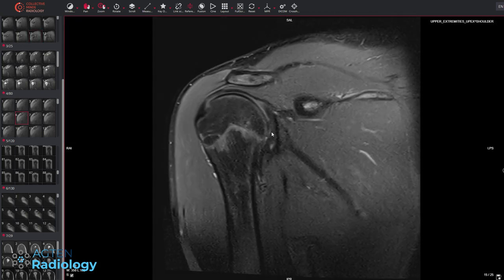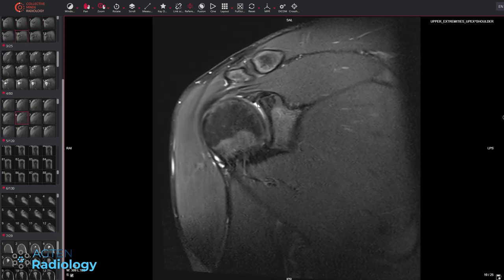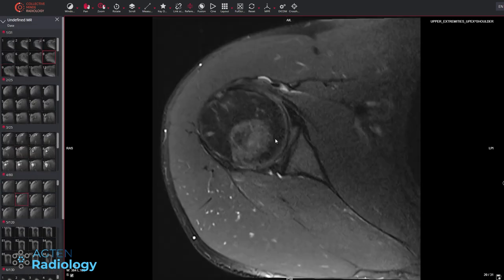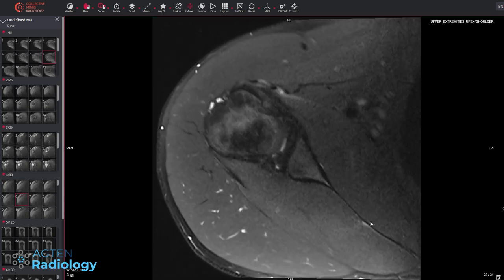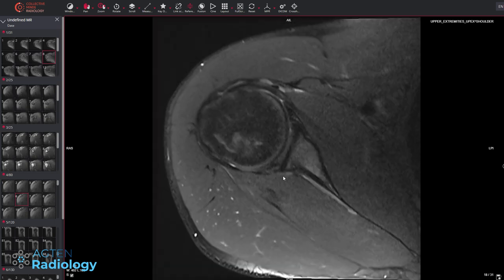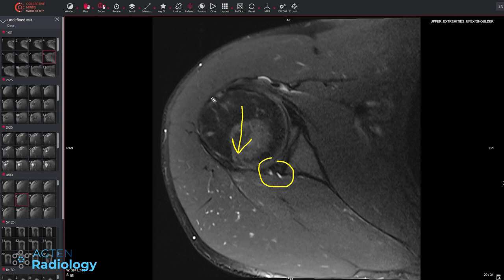Looking at the superior labrum: the biceps tendon runs over the subscap and goes inside — there doesn't seem to be a SLAP 2 lesion, so it's just this posterior labral tear. Interestingly, posterior labral tears are frequently seen in people with very bulky musculature like this. They likely do a lot of bench pressing — when you lift 100 kilograms on a bench press, the humeral head is pushed hard posteriorly, putting a lot of pressure on the posterior labrum. This combination is quite common.